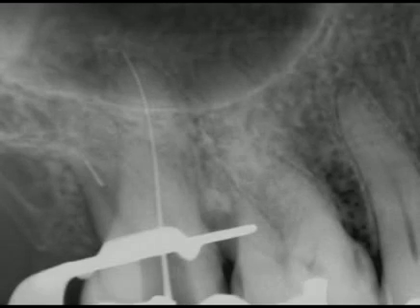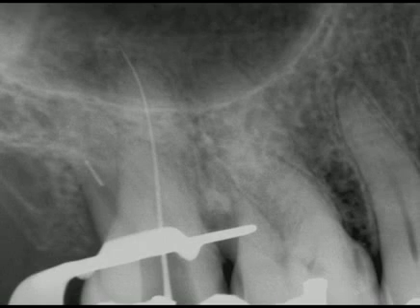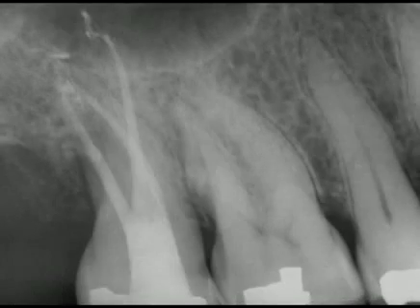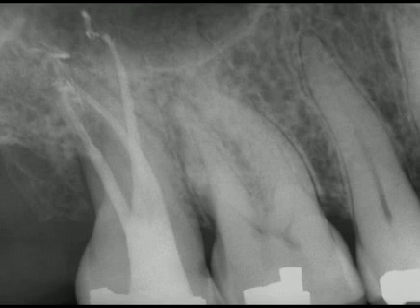Here is a working film of a maxillary right second molar. Notice a broken instrument in the DB root and an instrument that has negotiated the palatal canal. Notice in this working film I'm showing a more traditional method of bypassing the broken instrument with a small negotiating file. The postoperative film shows the retreatment efforts and the broken instrument has been entombed during obturation.